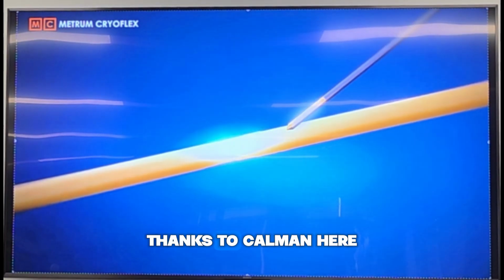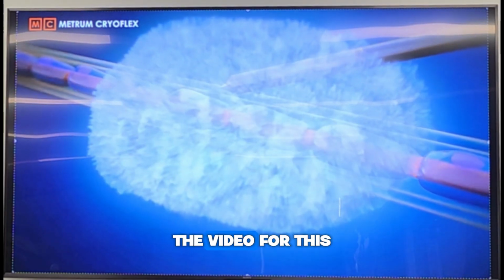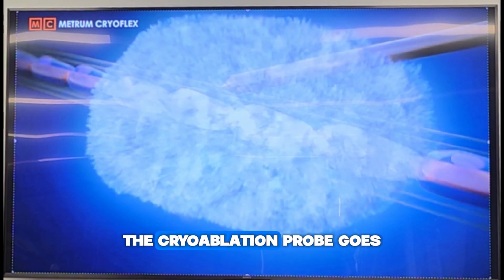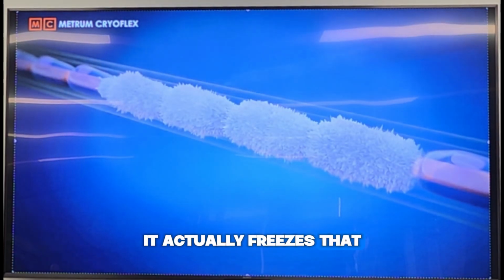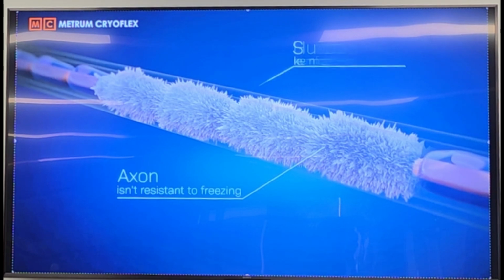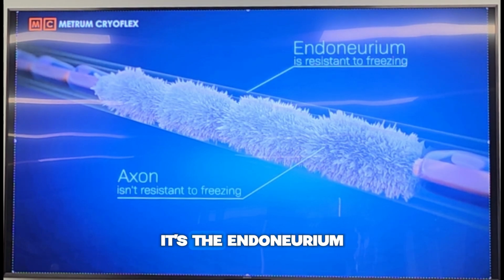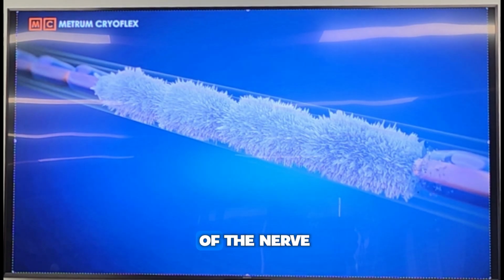Thanks to Kalman here, he's given us the video for this, but basically the cryoablation probe goes adjacent to the nerve. It actually freezes that nerve, and the axon isn't resistant to freezing. It's the endoneurium, which maintains the ultrastructure of the nerve.